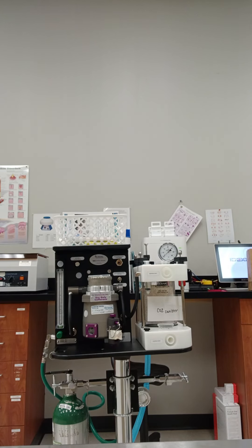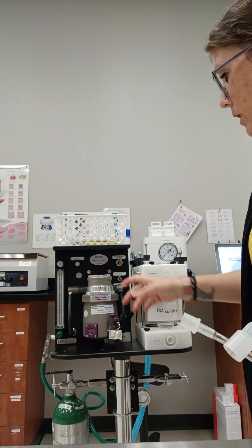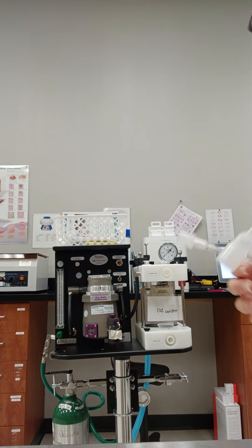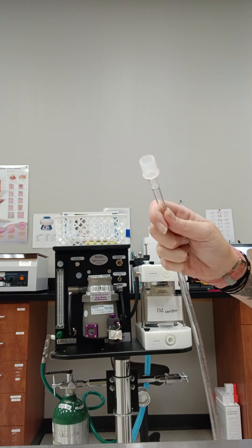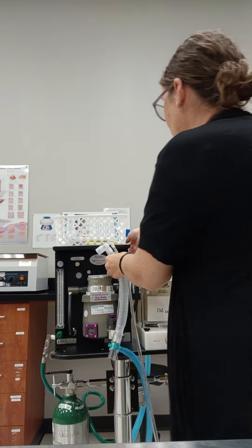We're going to set this machine up for non-rebreathing. This machine's a little bit different — it has a little switch back here that we're going to click up to non-rebreathing. And then we're going to put the machine end into the port that says non-rebreathing attachment.